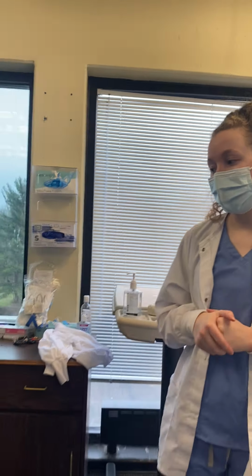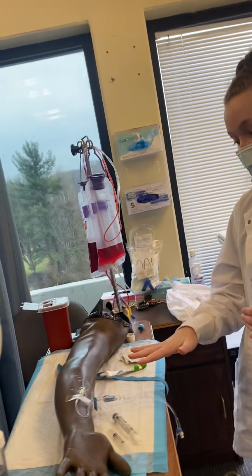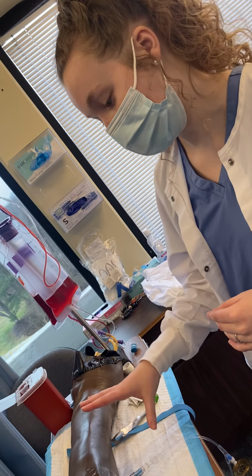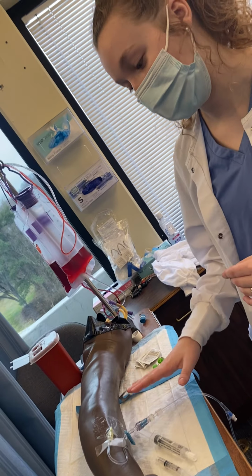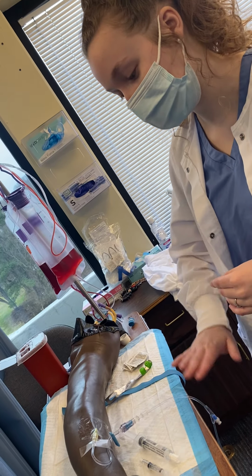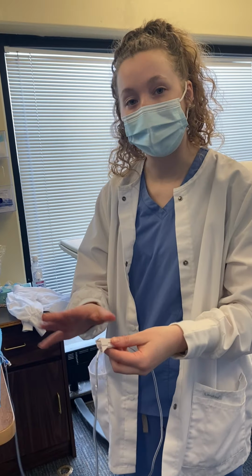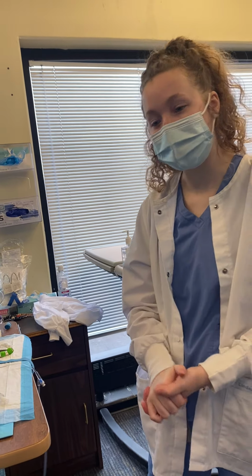So I've already prepared it, and I've used the 6 rights of medication administration: right patient, right medication, right dose, right route, right time, and the right documentation. So I'm going to assess my patient's IV sites for any complications, infiltration, or inflammation. I'm also going to ask my patient, make sure they're comfortable and that it's not bothering them. Everything looks good, so I'm just going to clamp off their medication that's running, or if it was on a pump, I would pause the pump. And then I'm going to wash my hands and put on gloves.